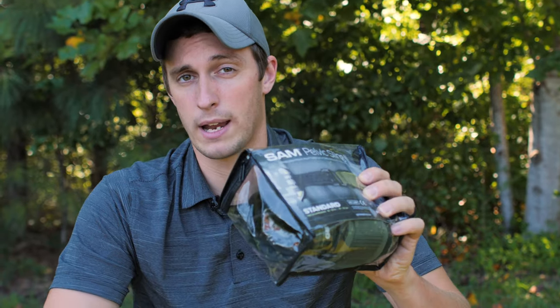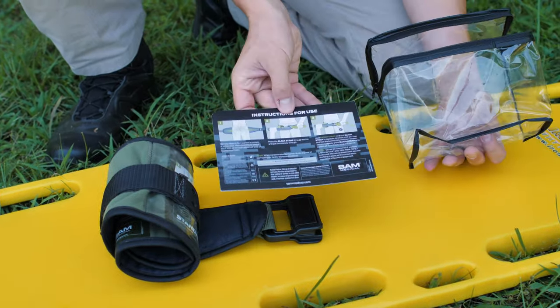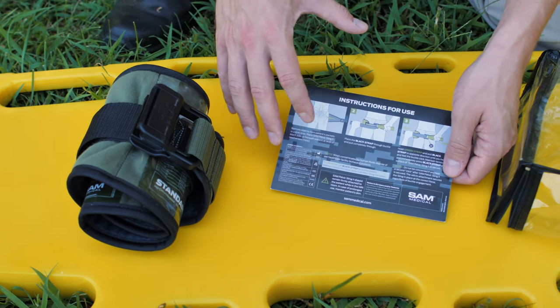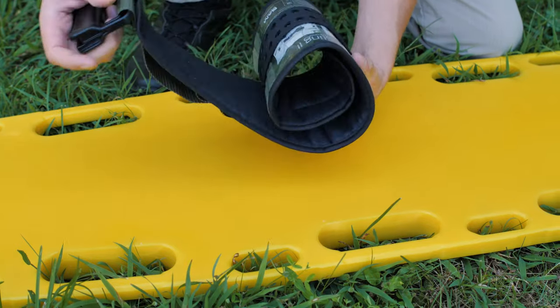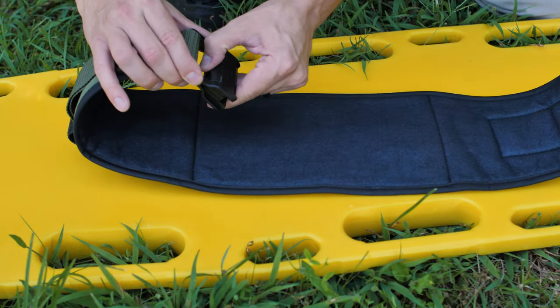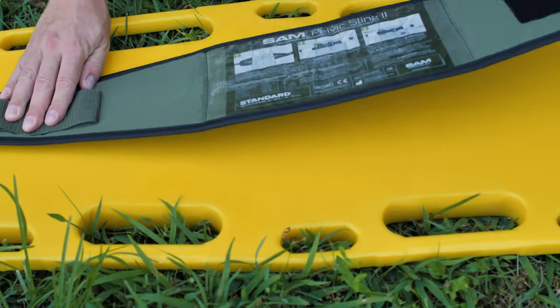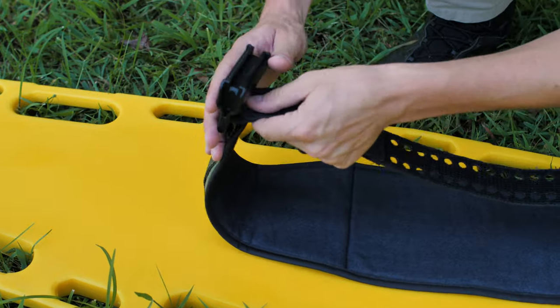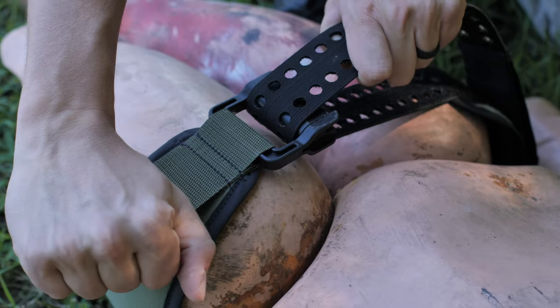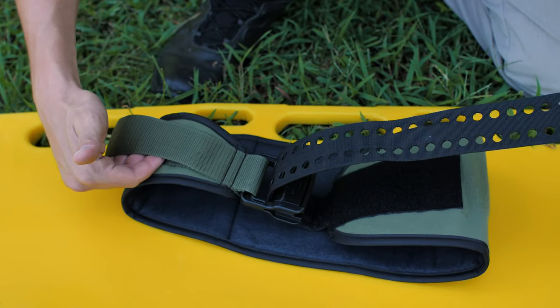The SAM pelvic binder is pretty small and lightweight. Inside there are instructions giving a quick rundown of placement and tightening. It also notes it can be left in place during an MRI or x-ray. Opening the sling, we have the area that goes underneath the patient. There's a Velcro strap on one side and a typical SAM buckle — the same used on their tourniquet and junctional tourniquet. We slide the binder underneath the patient, feed it through, and pull for pressure. When we've pulled enough, two small pins pop out and go into holes — that's how we know it's tight enough.